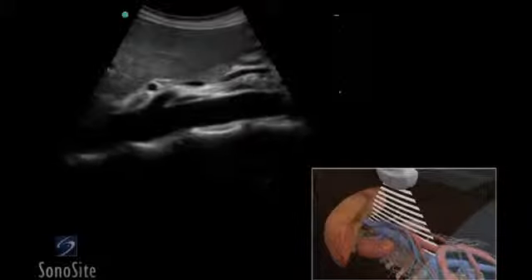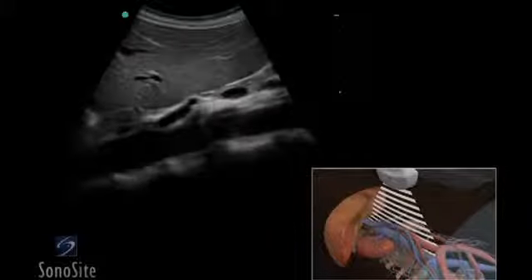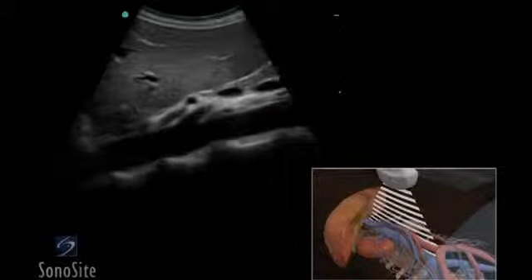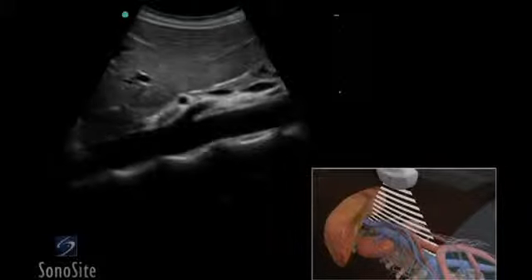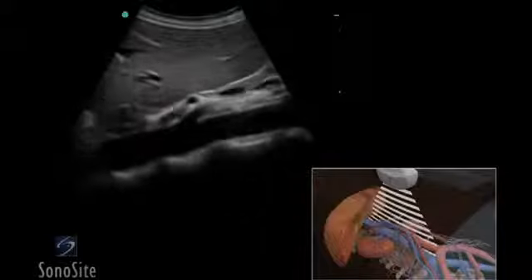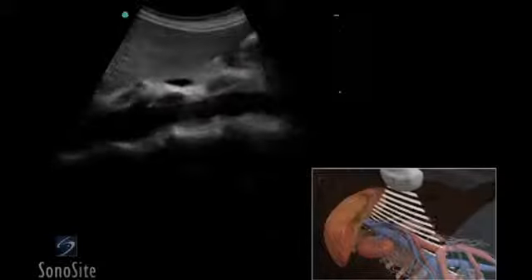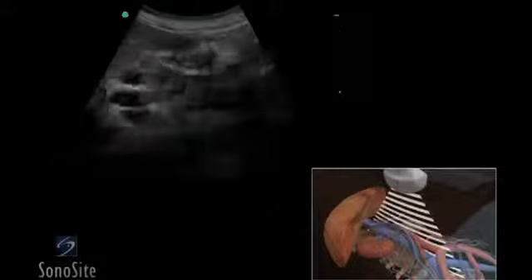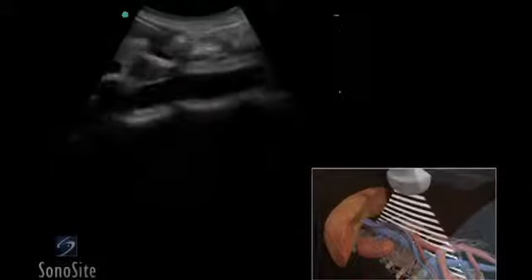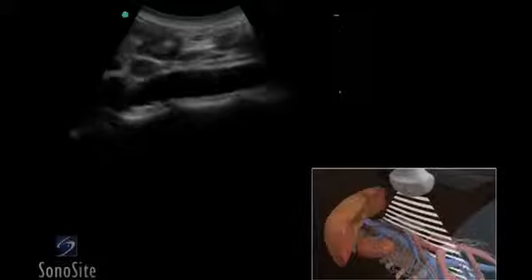The abdominal aorta will have proximal to distal taper. The transducer is moved distally to evaluate the walls of the aorta for any change in the shape or size.